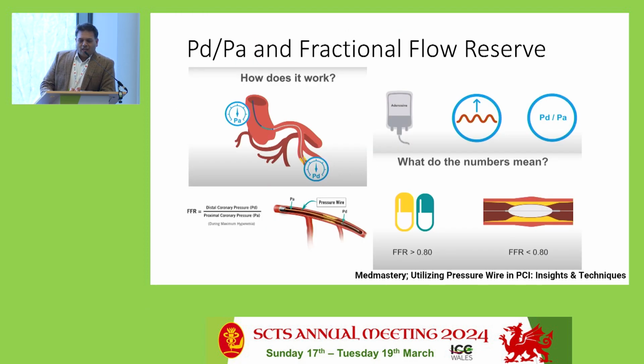In this diagram, what we're trying to do is assess the fractional flow reserve, which is the FFR, and if it is less than 0.80, that means that the lesion is hemodynamically significant based on the outcome data that we have from several studies. Now, of course, when you have a binary cutoff like this for what is a continuous variable, it's always difficult. So the initial studies looking in this area, such as DEFER and other studies, particularly looked at a lesser gradient of 0.75.